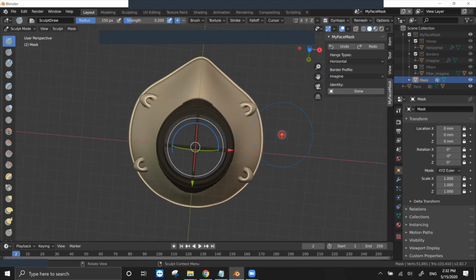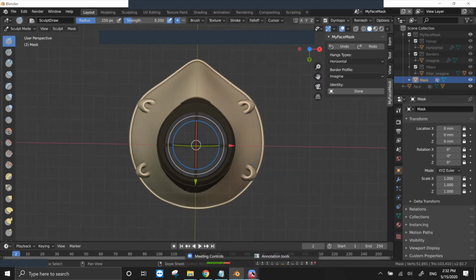Yeah, and it checked off two boxes for our criteria. One, we want to make sure it's biocompatible, meaning this material is going to be making contact with your skin for possibly long periods of time, so we want to make sure it's safe. Second, we wanted to make sure that you could sterilize the material too, or it would kind of defeat the purpose of these masks. Right.